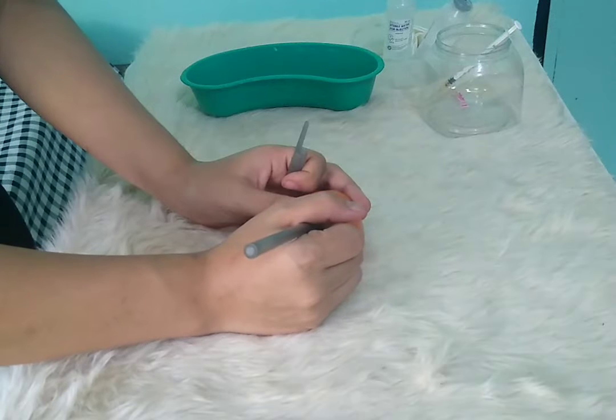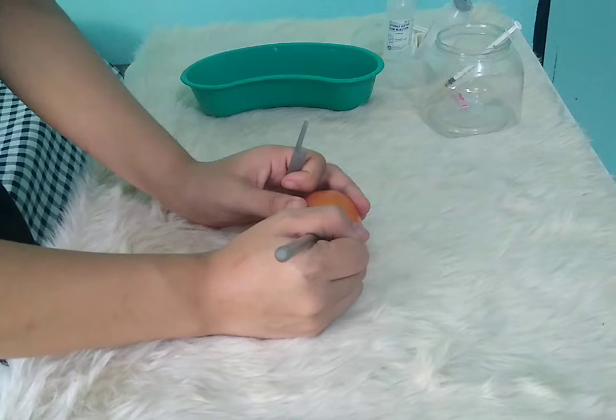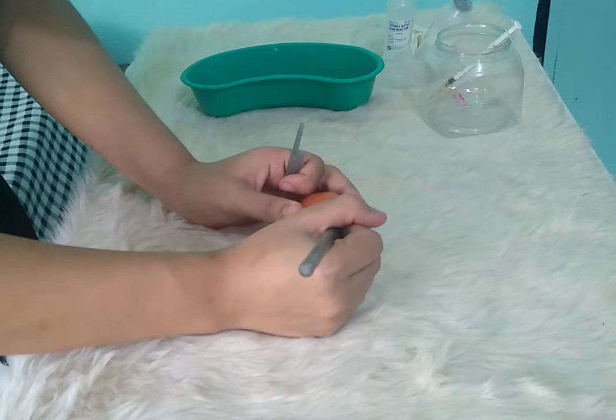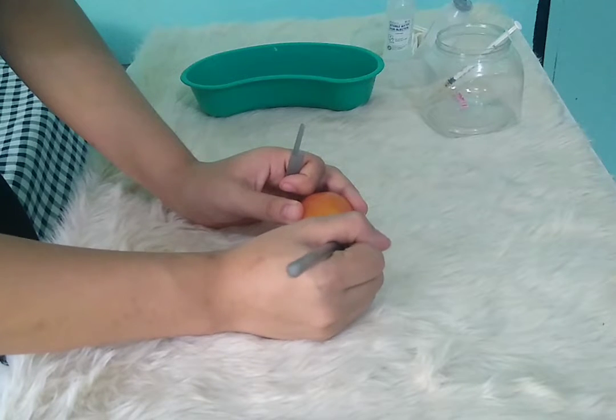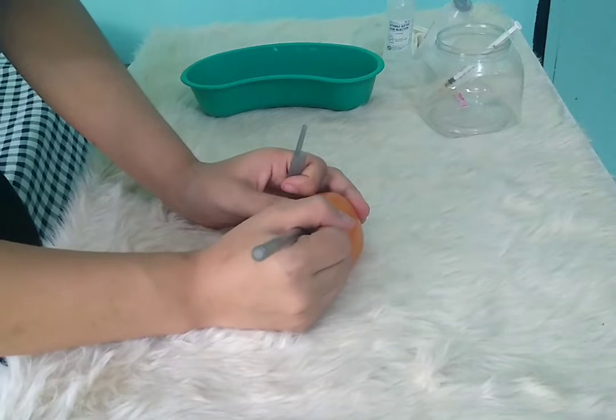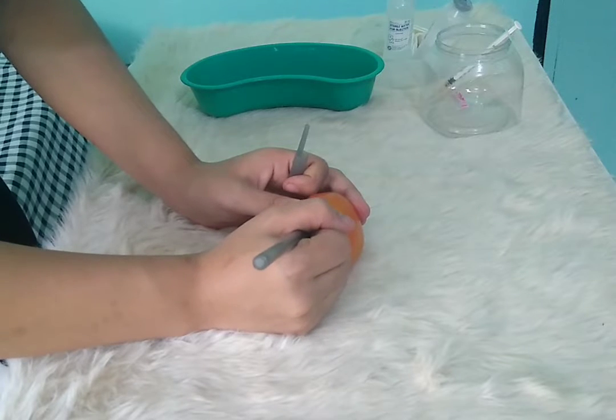Circle the injection site with ink to observe for redness or induration, hardening, per agency policy. Put the time and date of the injection, and also the time.